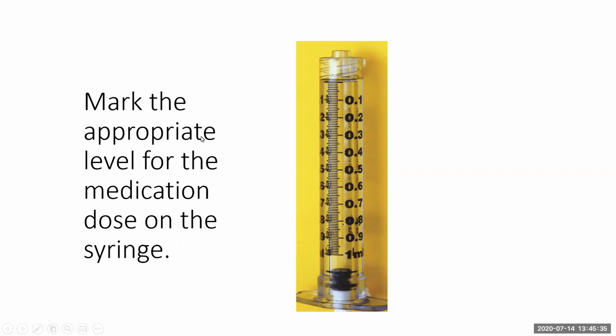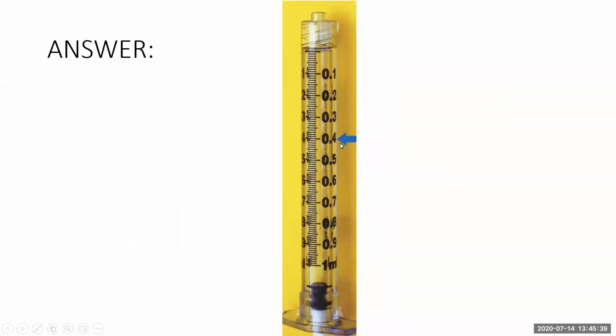All right, are you ready? Let's see if you're right. Here we are. Where this blue arrow is indicates the level at which you would pull up your medication. Right here at this long line that goes to the 0.4 is where you should draw up to your medication.